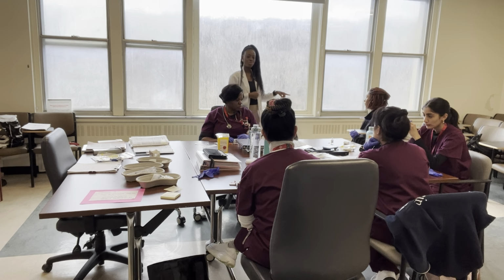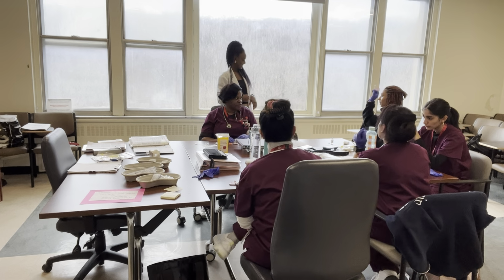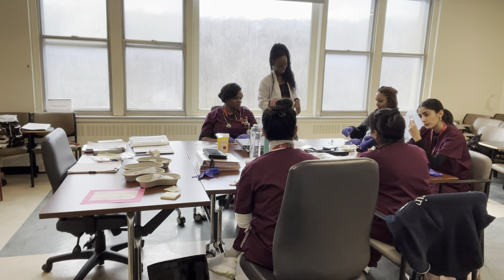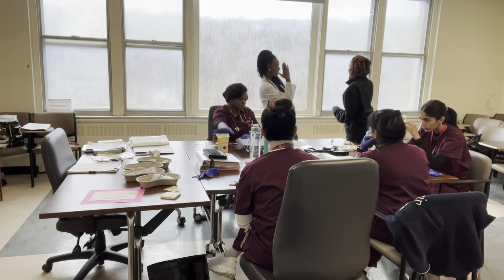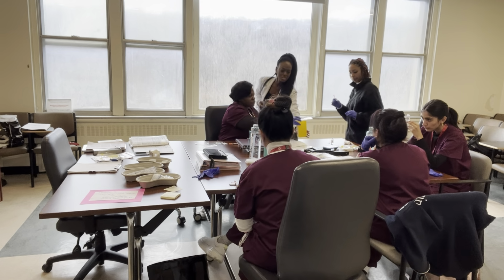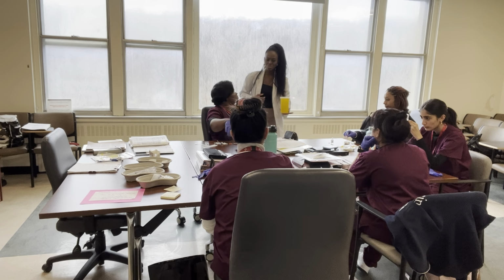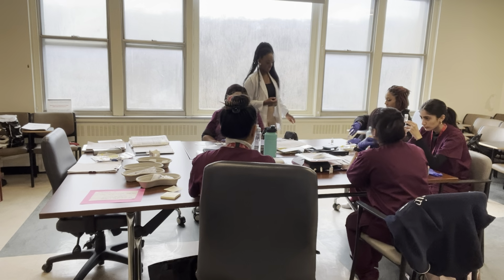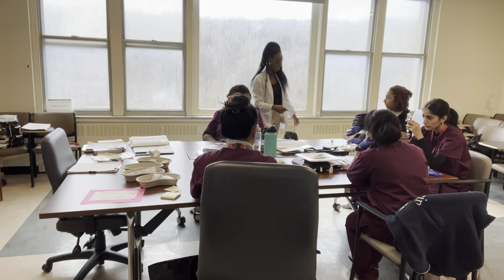So, what is she doing wrong? Oh, pass it down. Very tough. Sorry. So, I hold 5 seconds, and hold out, and then up in the air straight. No, no. Change your position. Go back down. No, hold, move this. Move this. Why would you move it, darling? I need this to be where she walks. Okay. Yeah, the way we do it. Okay, if you want.